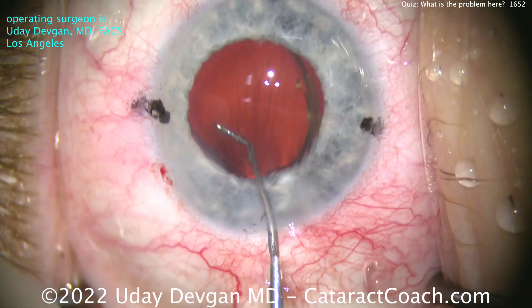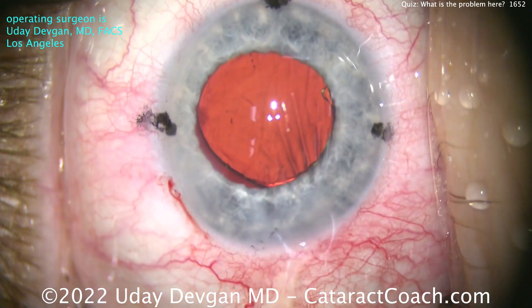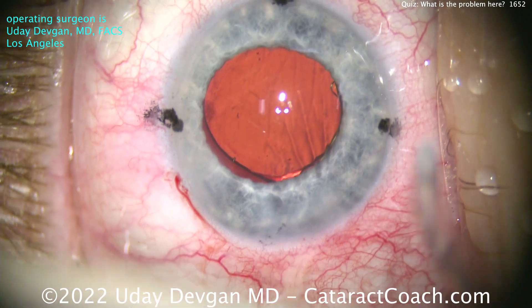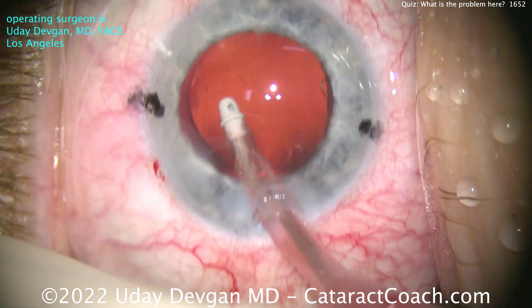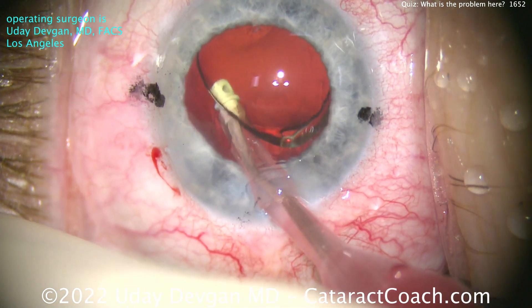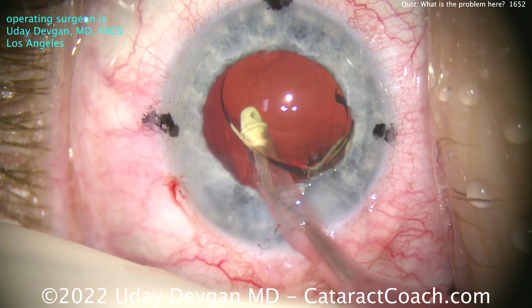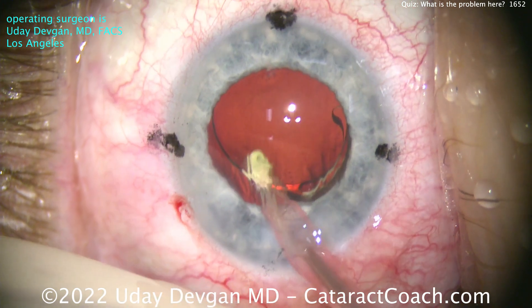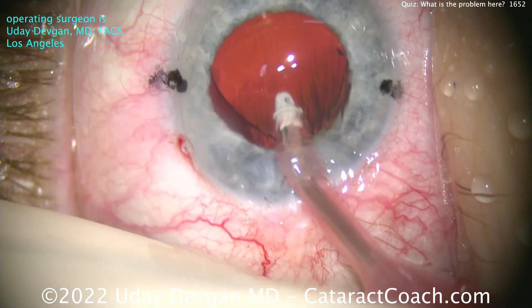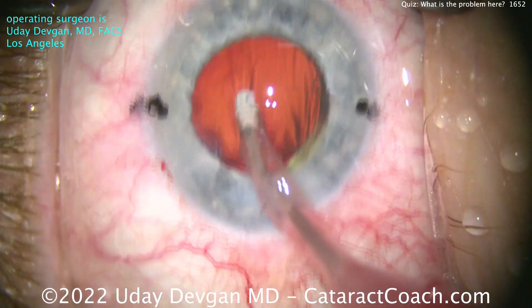Now adjusting it a little bit more using the chopper end. What do you notice? It's in the bag, but look at the right side of the screen — the haptic is still attached to the optic, a little adherent there. That's okay. Remove the viscoelastic from behind — viscoelastic comes out pretty quickly. Whoa, I don't want this IOL to rotate. Let's let go of the capsule — we don't want to do that. Put that capsule back, and now it looks pretty good, ready to go.